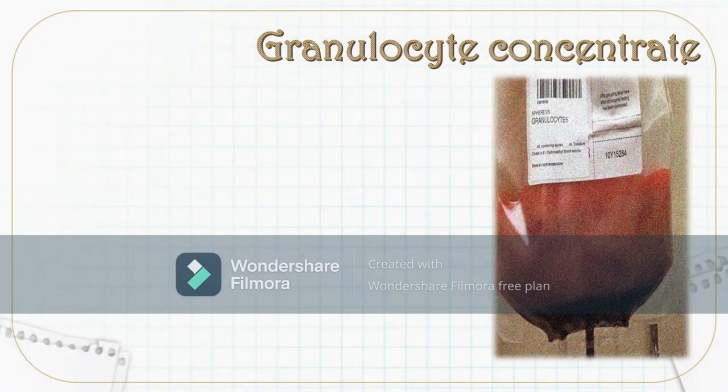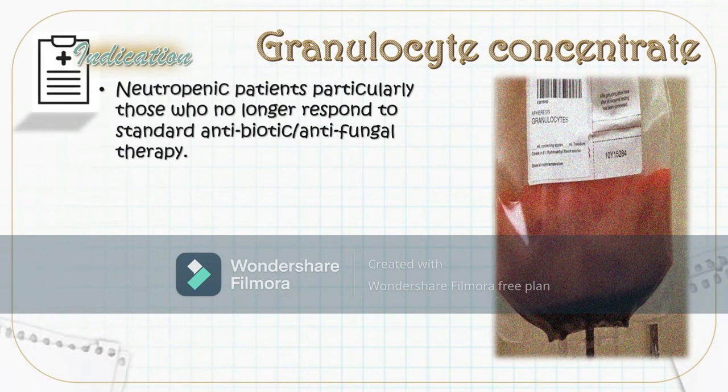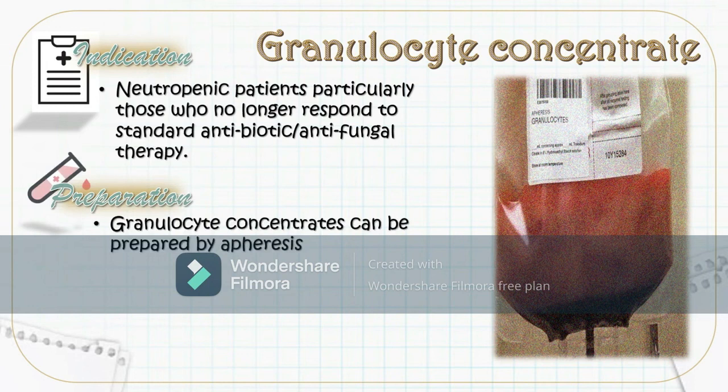Next, we have our granulocyte concentrate units, which are indicated for neutropenic patients or those patients with very low neutrophil counts, particularly for those who no longer respond to standard antibiotic or anti-fungal therapy. For its preparation, granulocyte concentrates could also be acquired through the process of apheresis.